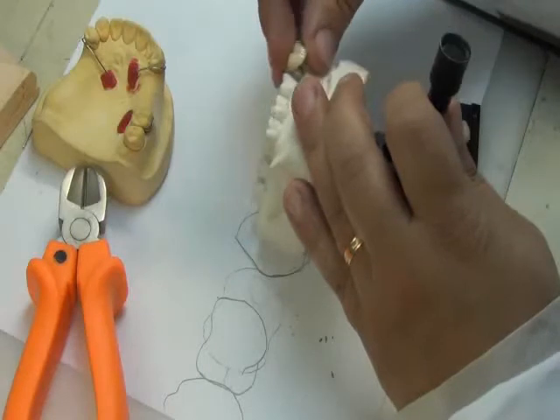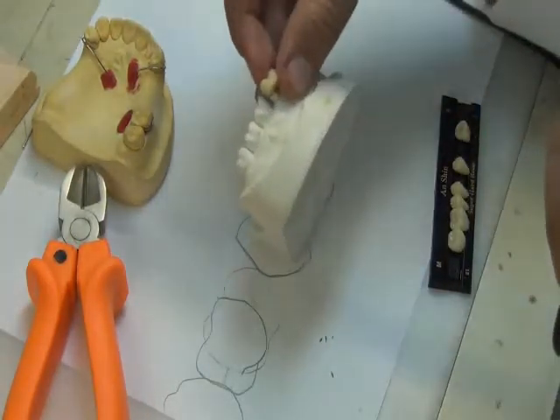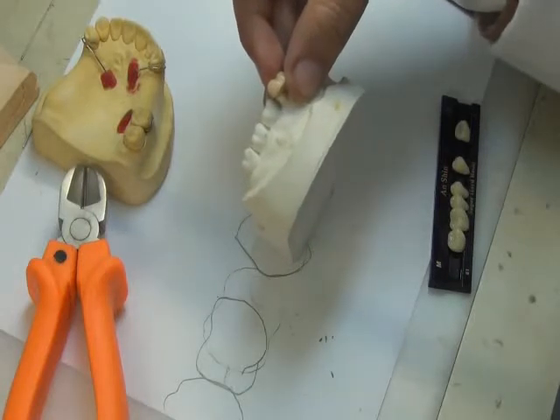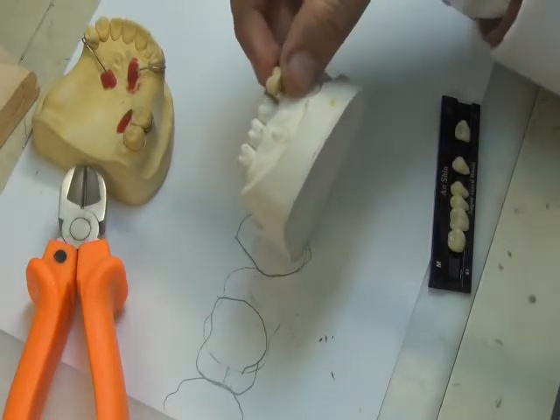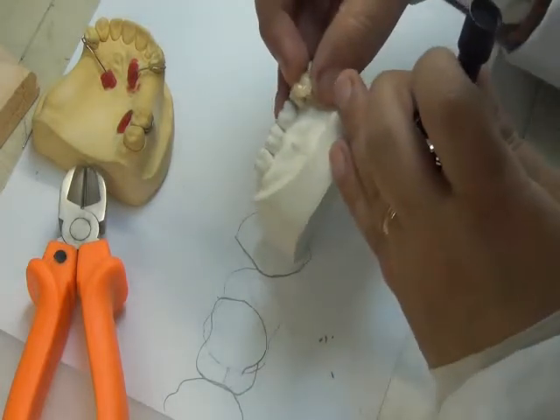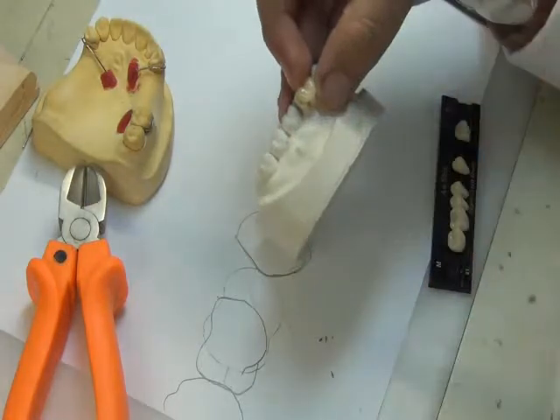Okay. Suppose I'm putting another tooth here. Do you see this? Occlusogingivally, this tooth is short. Okay? So I need to make sure that also my tooth from occlusal till gingival end is the same.